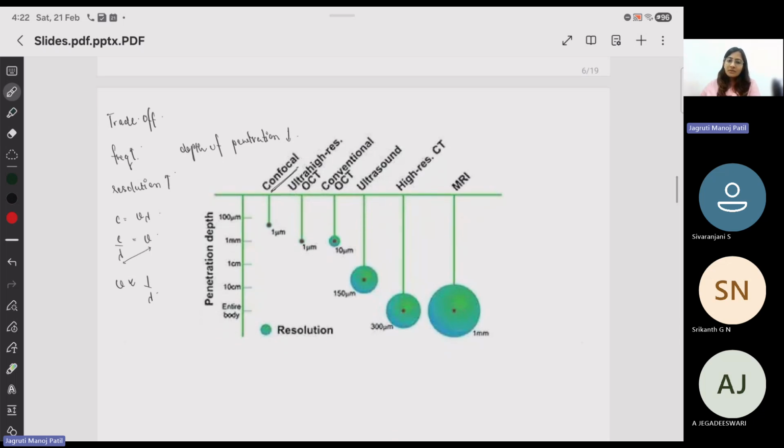Now imagine you're putting a slide and you have these microbubbles on top of it. They would flow up, or at times they won't stay on a single site at a time. Whenever you're doing bright field imaging, you'll have multiple planes all together. Depending on your magnification, where you're focusing, and your depth of field or the aperture you're looking at, you'll only be able to image one single plane. You'll have shadows in your image which tell you that in some other plane, in some different field, you're seeing a different population.